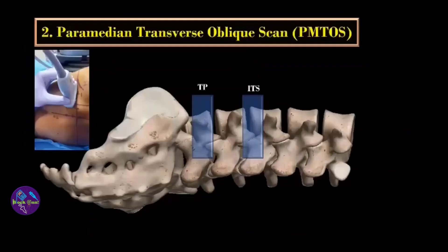The next approach is the paramedian transverse oblique scan. Here, rotate the probe 90 degrees from the previous probe position and you will have two windows: one through the transverse process and the other through the inter-transverse space. Since we cannot see beyond the transverse process, we choose the inter-transverse space window to visualize the lumbar plexus.